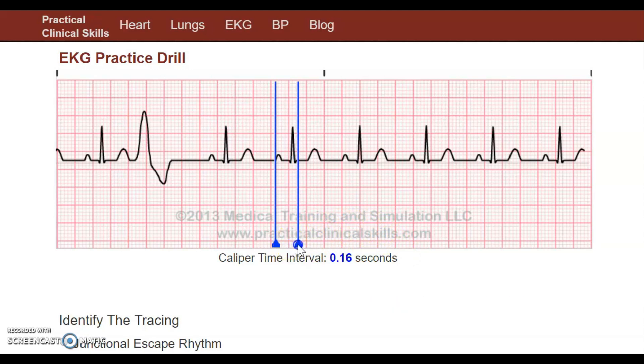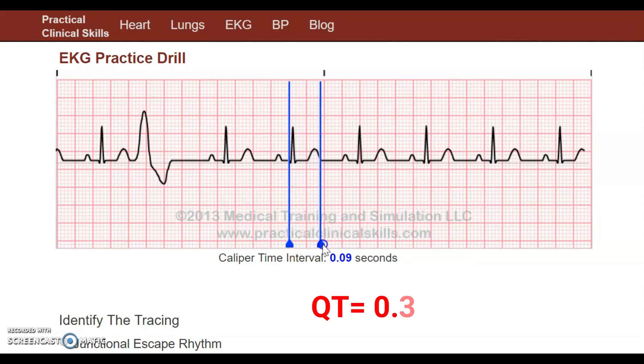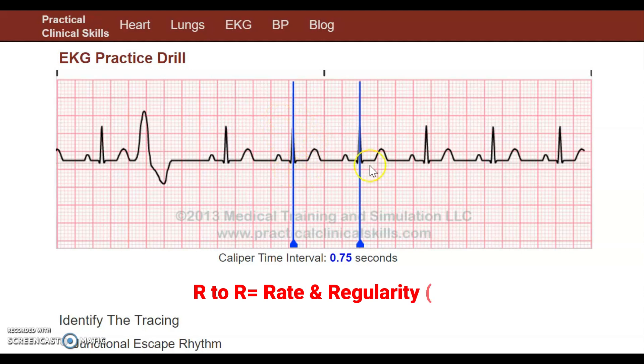Next we're going to measure our QRS complex, which has to be between 0.06 and 0.10 seconds. It's 0.09 seconds, so we're good. Next we're going to measure our QT interval - from the Q to the end of the T wave. Generally you want this to be between 0.35 and 0.44 seconds. It's 0.37 seconds, so we're good. Now we're going to measure our R-to-R interval, from one QRS complex to the next, which will measure rate and regularity.